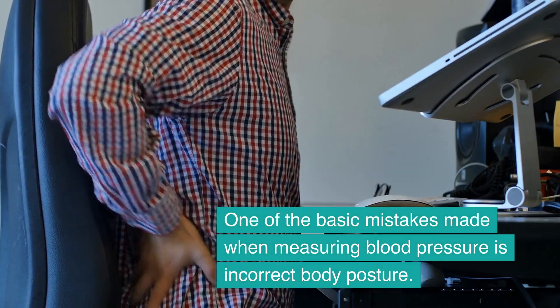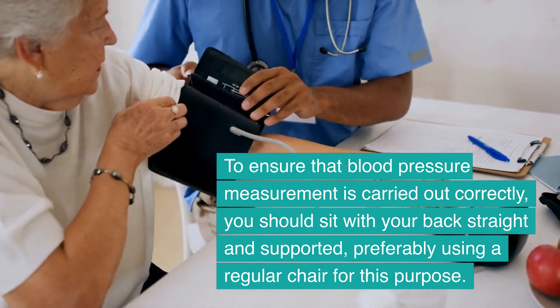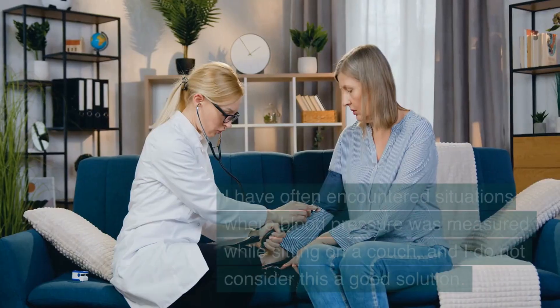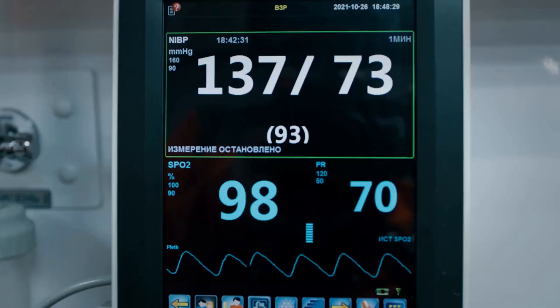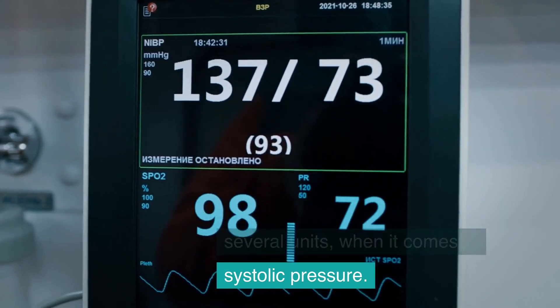One of the basic mistakes made when measuring blood pressure is incorrect body posture. To ensure that blood pressure measurement is carried out correctly, you should sit with your back straight and supported, preferably using a regular chair. A slightly hunched or unsupported back can give a result higher by even several units when it comes to systolic pressure.